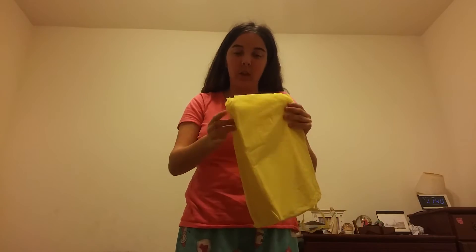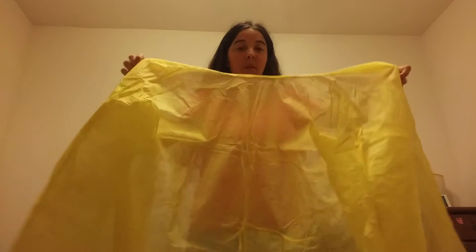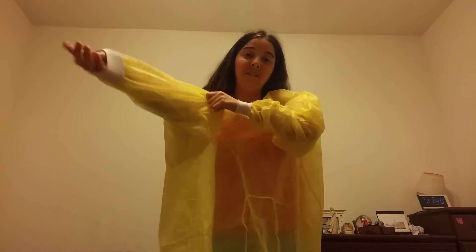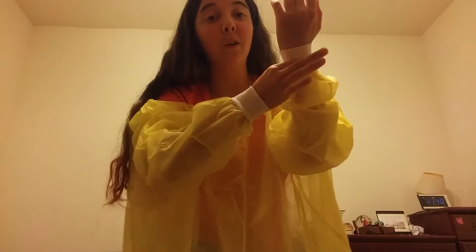So you open up your robe and it looks like this — the back is open. You put your arms through the holes, and the robe has these white parts that will come in handy when you need to take it off after you're done.